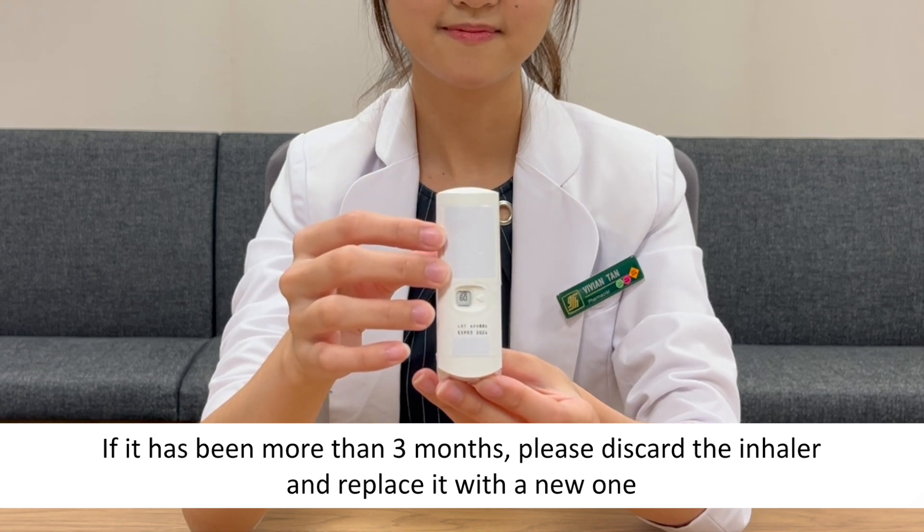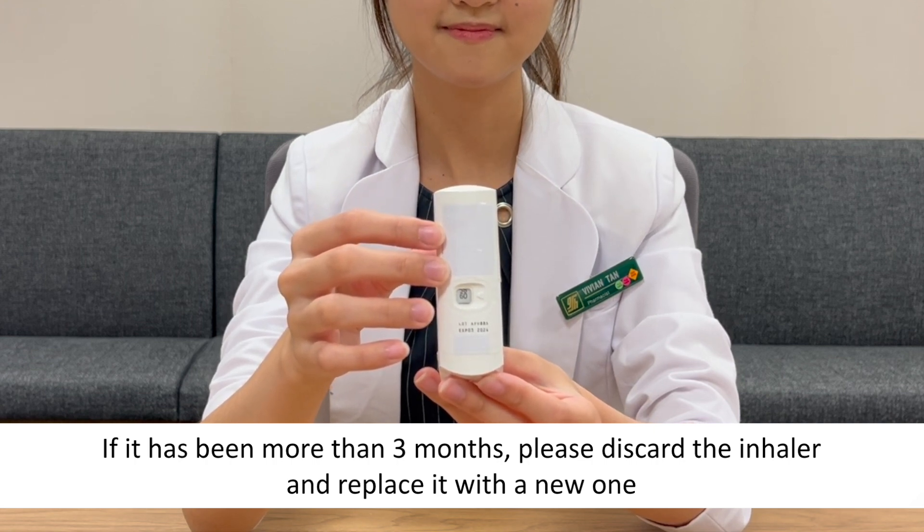If it has been more than 3 months, please discard the inhaler and replace with a new one.